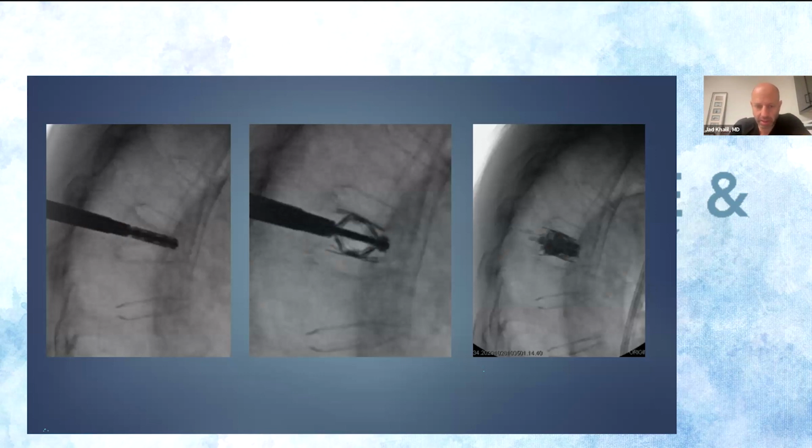You always get a better expansion than you think you're going to get, especially on a freshly acute fracture within the first few weeks. When you're going into two to three months after, typically I would not see such a great expansion. We can talk all day long whether we should treat those fractures at all or not. But I would say with SpineJack, earlier is better. Even with balloon, earlier is better if you commit to treating those patients, of course, granted the indications for treatment are there.